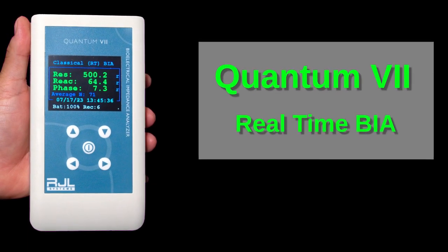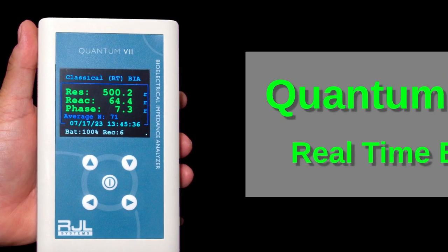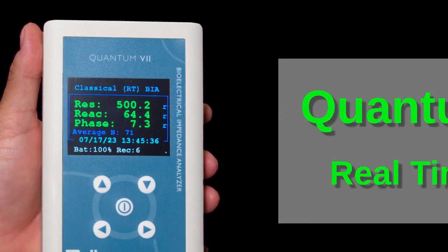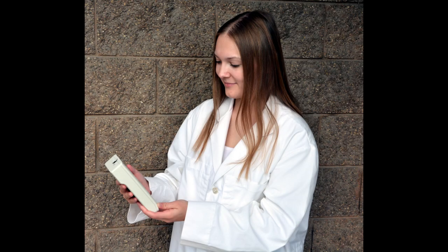Introducing the new real-time Quantum Systems with advanced features for healthcare professionals and clinicians. What is the Quantum VII BIA? What is it used for? And how to use it?